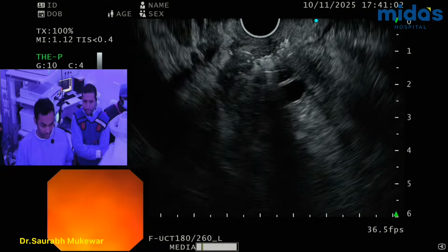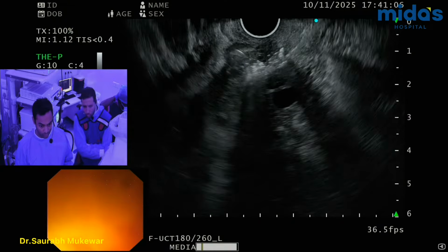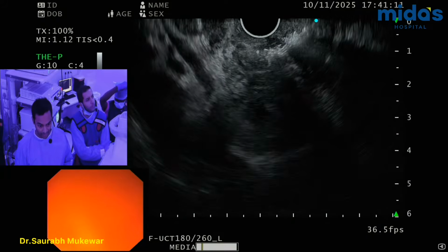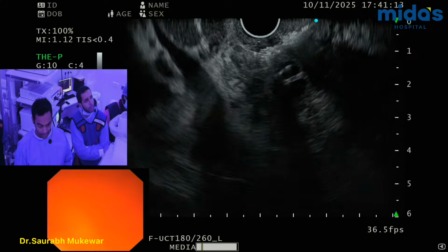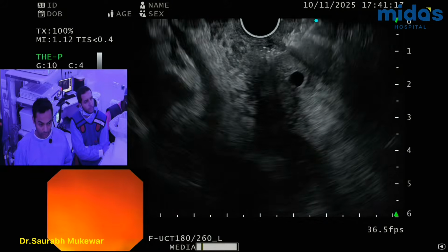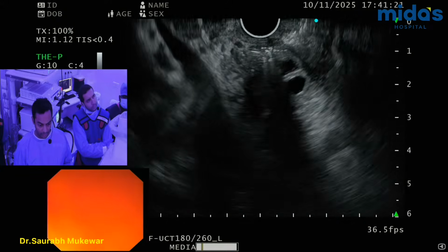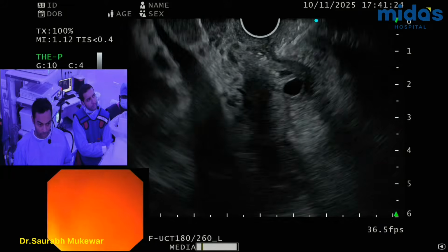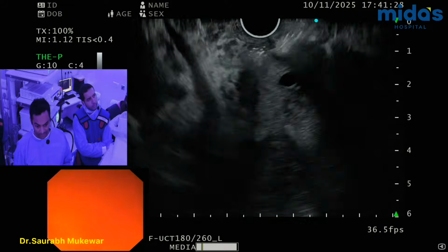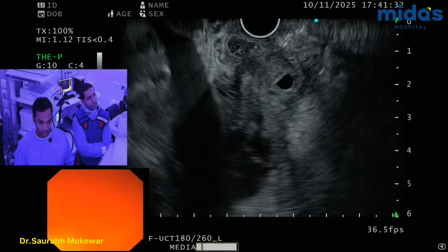Next change. Oh my god, this is a bad angle, man. Oof. Okay, I'm not happy. But we are going to have to get a lot of synchronization. Stop. Pushing. Okay, negative, pulling back. Again, 1, 2, 3, pushing. Okay. This is the problem one. This is going to be a challenge. Okay, so I have to do a lot of synchronization.